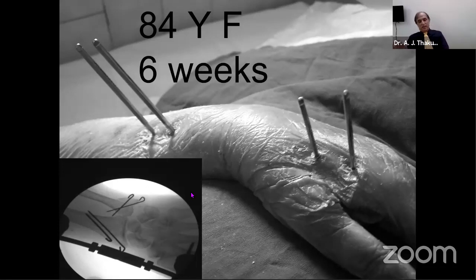skin is dry. Once the dressing is applied, I see them regularly at 10 days interval, but do not change it unless there is some issue. If there is discharge, I can make out from outside, or if there is swelling, or the patient tells me there is some kind of discomfort at that side, I change the dressing. In fact, I reinforce it with a little more gauze piece to make it more stable and keep the skin non-mobile and permanent. At 6 weeks, an elderly patient, no discharge whatsoever.